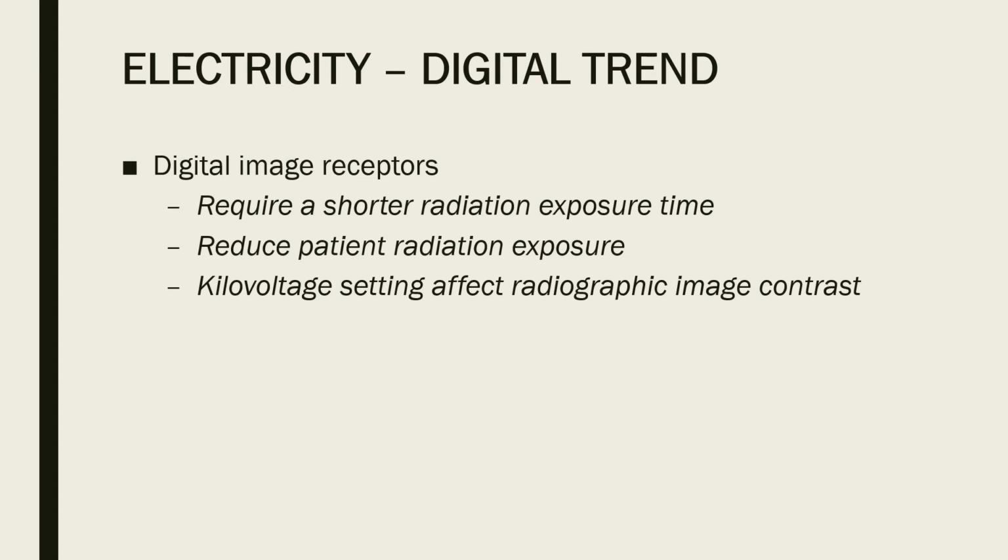And as we've learned earlier, great or better quality radiographs can be produced if the kVp is between 60 to 100. So a slight reduction in kilovoltage to reduce the exposure of the patient may affect radiographic contrast.